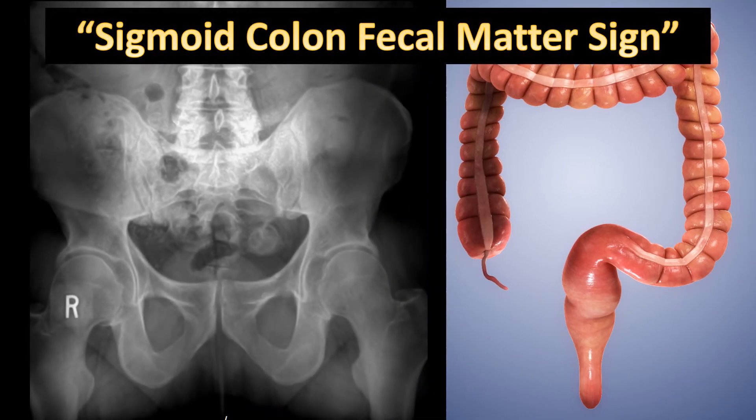Since there is no named radiographic sign for this appearance and I have doctors ask me about it all the time, I'm going to call it the sigmoid colon fecal matter sign. That's just that round density in the left aspect of the pelvic basin representing prominent contents inside of the sigmoid colon.